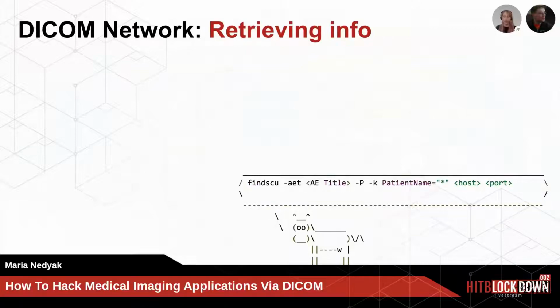What is an application entity title? An application entity title is an option of the DICOM server. It is used to create some kind of user access. For example, different PACS systems use one DICOM server, and to set up different storages, you use the application entity title.